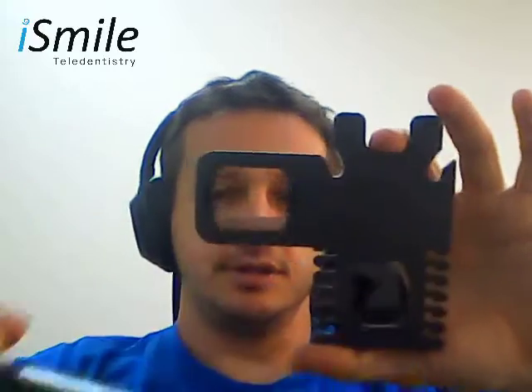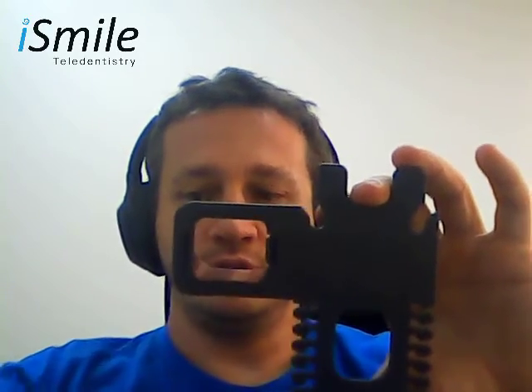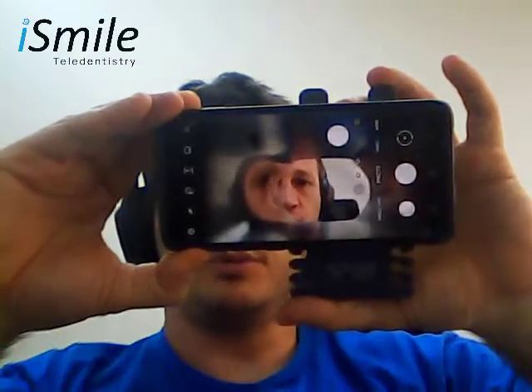Count the number of ridges on the bottom to the bottom of your phone. In my situation, we can see that the bottom of the phone is positioned four ridges up from the bottom of the scanning device.